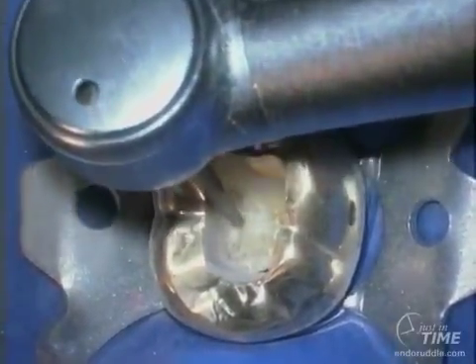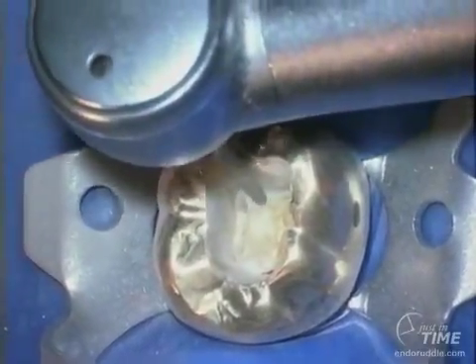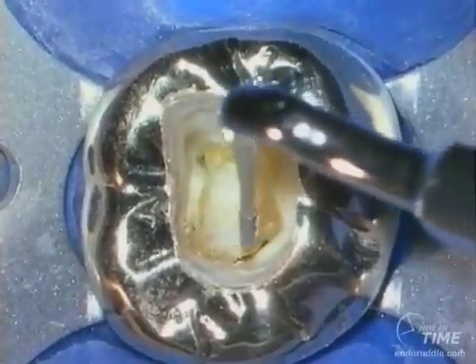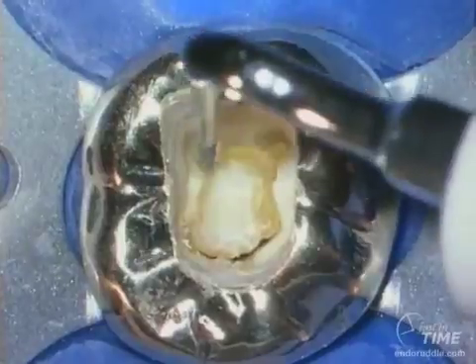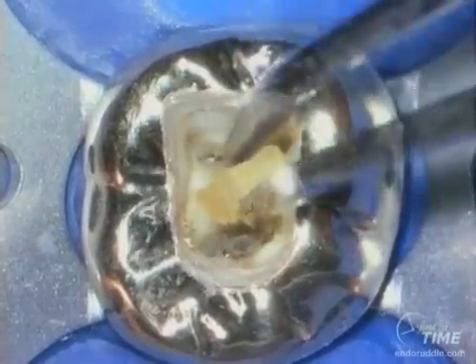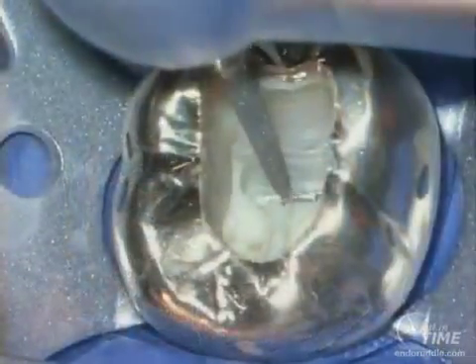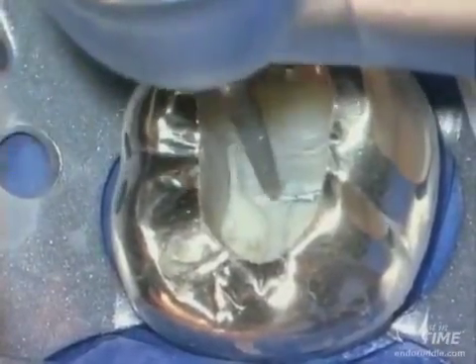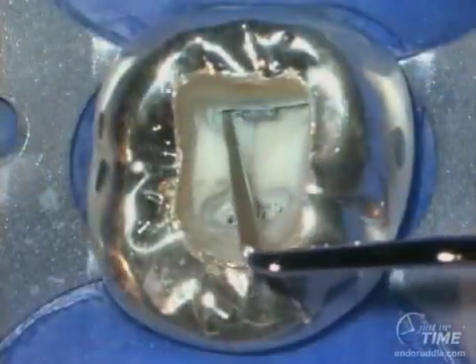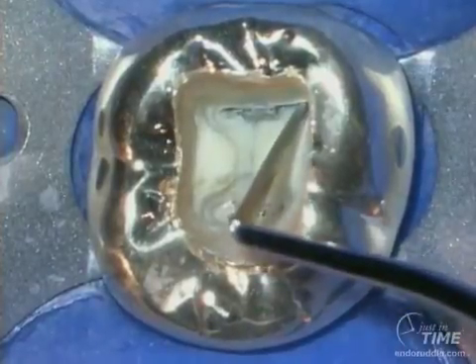Using a surgical length diamond with 12 millimeters of cutting abrasive, we can begin to flatten out our walls. We are expanding our access walls axially to the mesial. Now that the stone is exposed fully, ultrasound is a very good adjunct to break these things up — sometimes they'll disintegrate into countless pieces, and other times you'll have the pleasure of removing a fairly significantly-sized stone. Notice the occlusal-gingival dimensions. Anybody can cut a hole into a tooth, but great clinicians like to finish those holes superbly. Notice the walls are all nice and flat — this allows us to reflect light off those walls so we can see pulpal floor anatomy better.